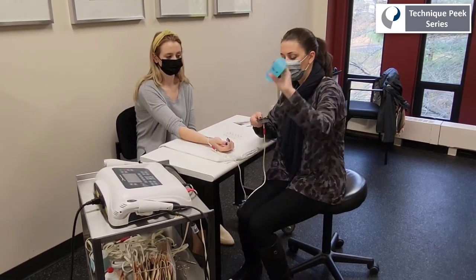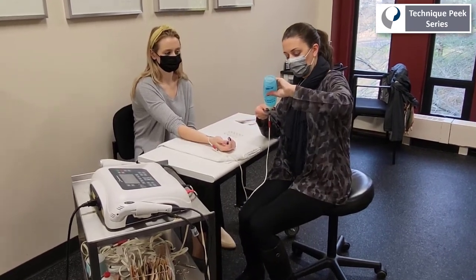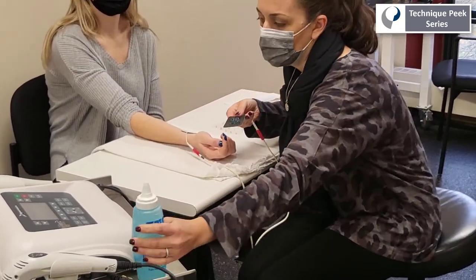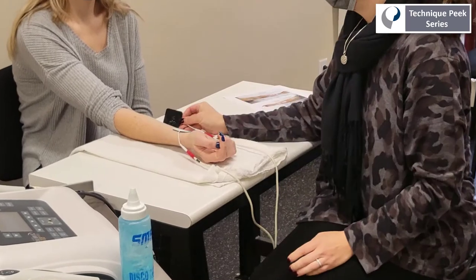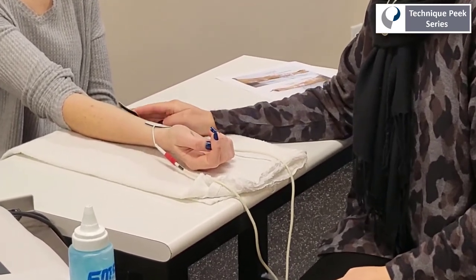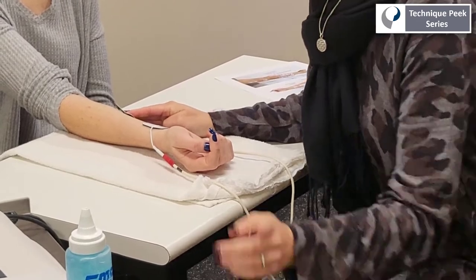In this case, we can use a technique where we place ultrasound gel on the proximal pad. You can place it on the skin and turn on the stimulation. With the gel, we're able to move the pad around to try to locate that desired muscle mass by looking for that contraction.